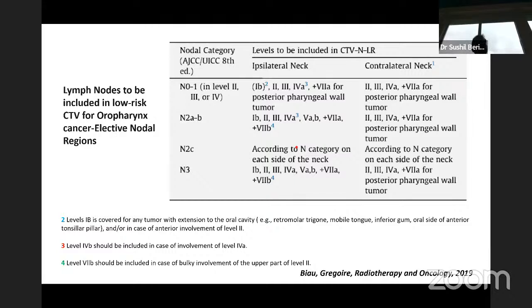So the basic difference between 2D planning and 3D planning is that you can paint your dose. So you can treat more neck on the side of involvement, less neck on the side of no involvement. And the important thing, we talked about it, is the salivary gland tolerance. The dose to the salivary gland, we say, is 26 gray, but it's not an all or none phenomenon. It's a sigmoidal curve. So 15 gray is better than 26 gray, 26 gray is better than 36 gray. So on the side of involvement, you don't necessarily need to spare the parotid. But on the uninvolved side, you can try to spare the parotid to a lower dose.